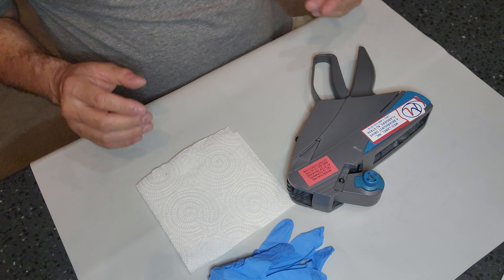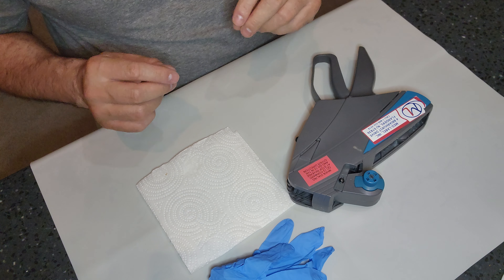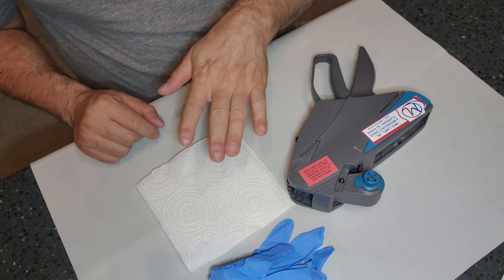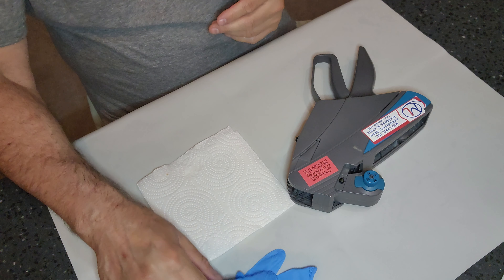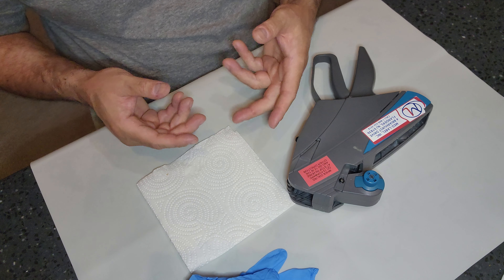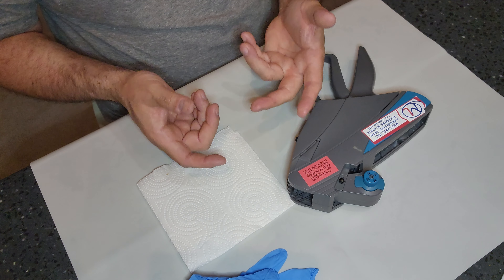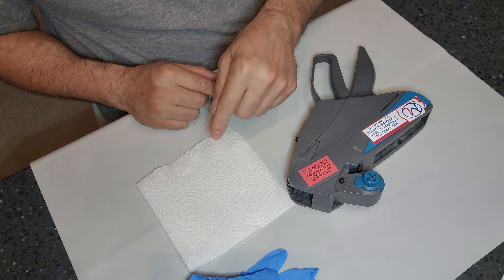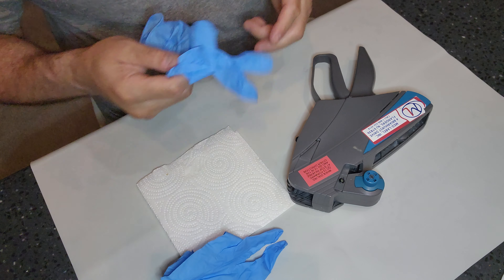What you're gonna need is your sticker gun, an absorbent liner, and of course some gloves. Unfortunately I don't have a new ink roll to put on there, but I'm gonna take off the one that's in there and show you how you would actually load up a brand new one.